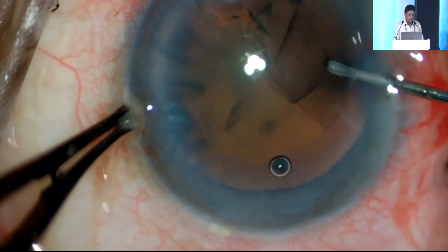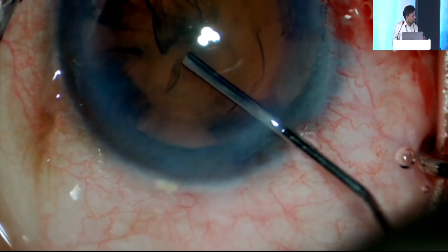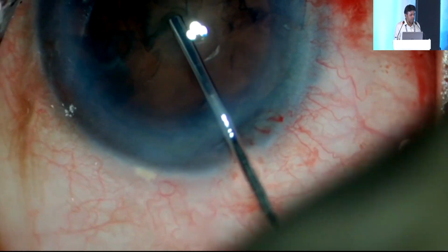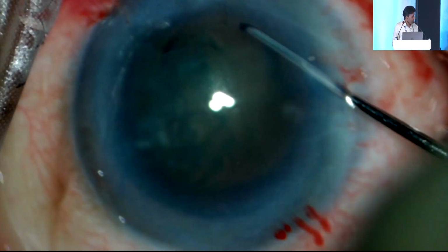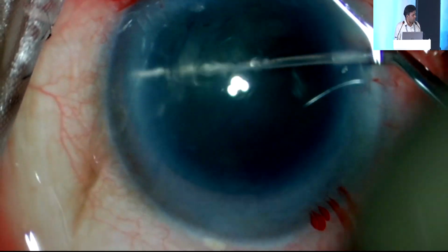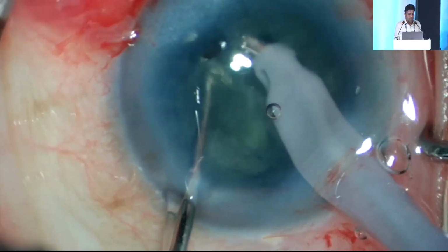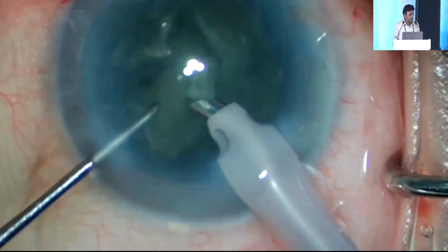Everything seems to be fine. All the steps were done and all went very smoothly. I have shared a few details: even the hydrodissection was complete. It was possible for me to do a complete nucleus rotation, and the whole of the emulsification procedure was smooth and seems to be uneventful for me. Everything went very smoothly until I removed the last piece of the cataract.